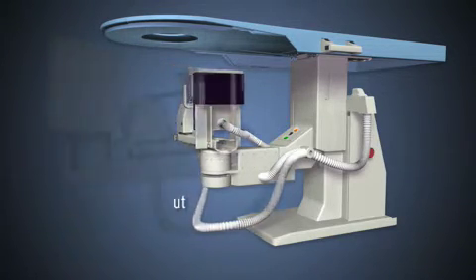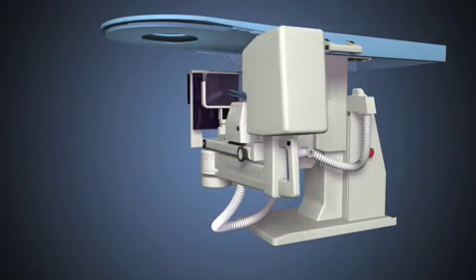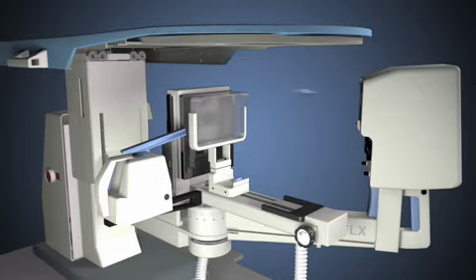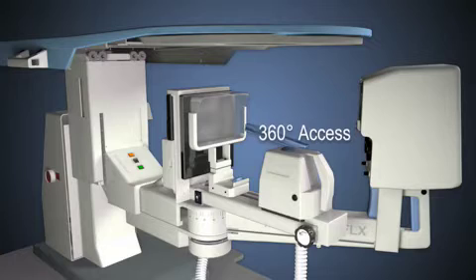The unique design of the MAMO Test Flex provides the best technology available while offering the patient complete comfort. Notice how the system provides 360-degree access without having to reposition the patient.